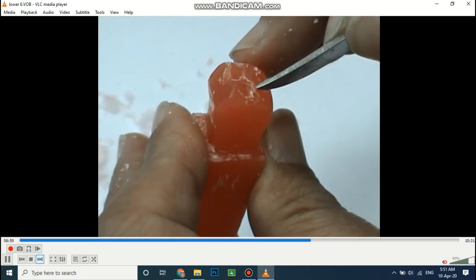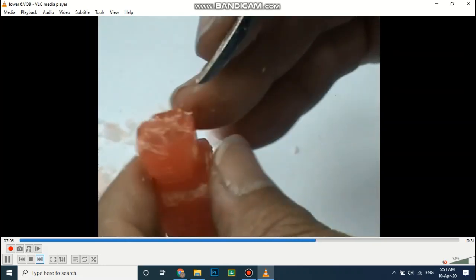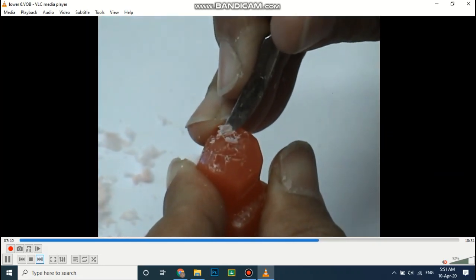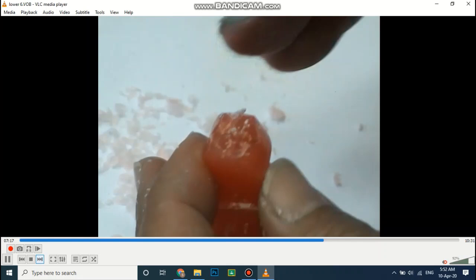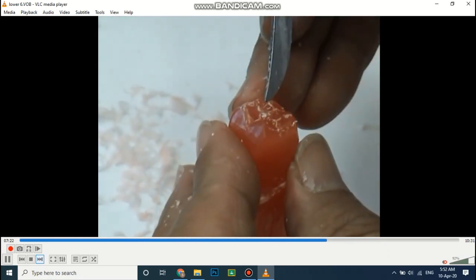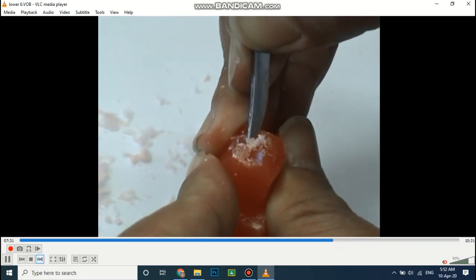For the mesiobuccal, also its triangular ridge should be looking forward towards the lingual surface, with gentle removal mesially and distally. Pay attention here, we have the triangular fossa and V-shaped notch, thus the wax should be gently removed. The distobuccal also looks forward, with gentle reduction of the wax mesially and distally, like that.